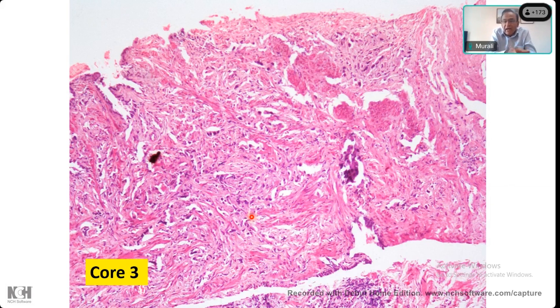Sometimes they start hormones before, if he has clinically obvious cancer, and this can all be hormonal effect, in which case you'll end up overgrading the patient. Typically post hormones, when they do a biopsy, you get very atrophic glands, very scant cytoplasm, and the nuclei become very dense, lymphocyte-like. So when you see this appearance, in my practice I would start suspecting that this patient might have had hormones.